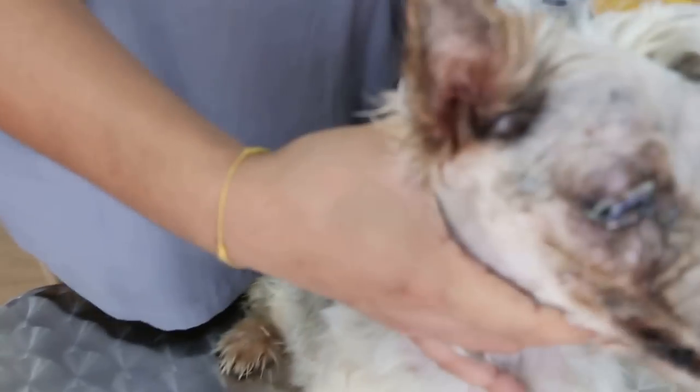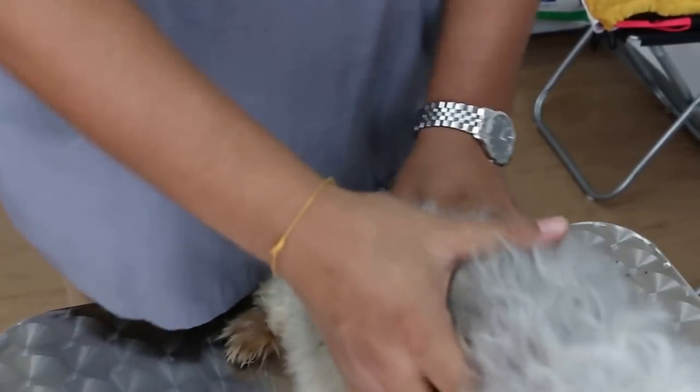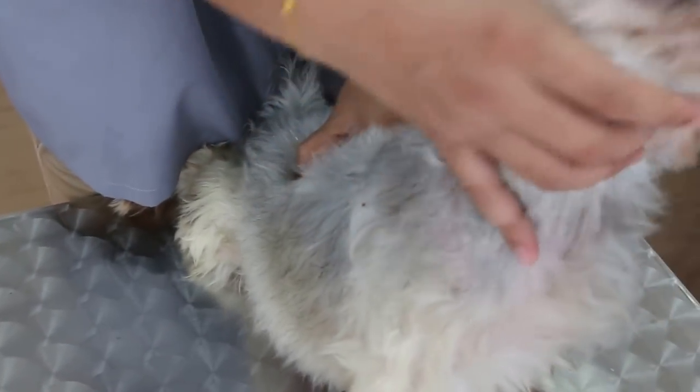This condition is called deep ulcerative keratitis. His vet advised enucleation, which is the surgical removal of the eyeball. The owner inquired about an alternative solution to save the eye. The eye had no intraocular infection. Therefore, the vet at Topayo Vets proposed tarsorrhaphy with third eyelid flap, and this has been done.